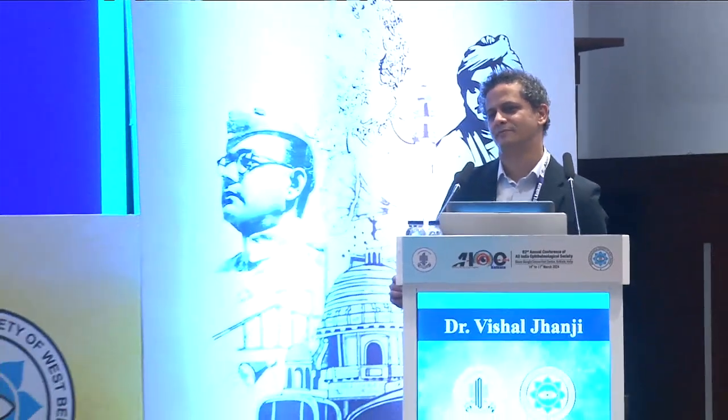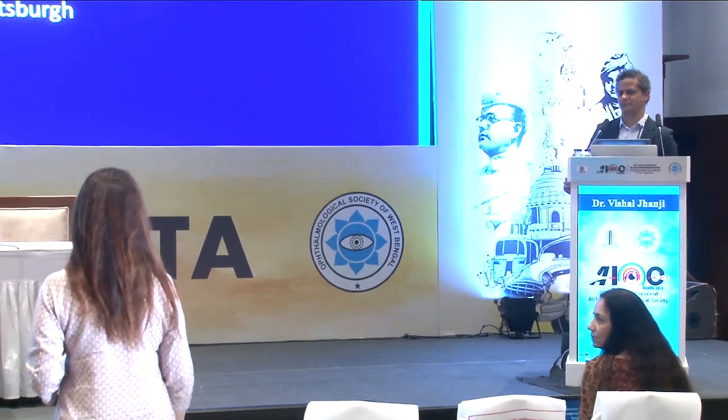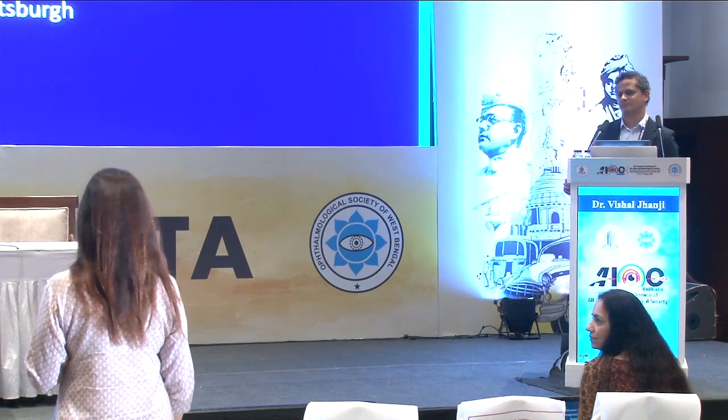You can start as early as 2.5 weeks, but following a DMEK, I actually wait a full 6 weeks. 6 to 8 weeks, and I let them know that they're going to have to wear their glasses for 6 to 8 weeks before doing the first adjustment.